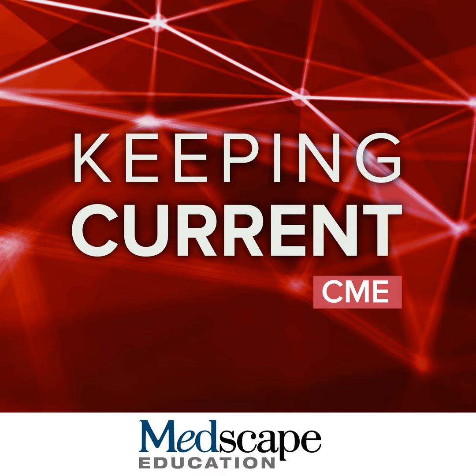Then the other categories, when we look at how we would score this, would be a subthreshold case. So here, in the middle set of images, we have an 8 millimeter lesion in the left hepatic lobe that is mildly T2 bright. That's not a cyst or hemangioma. That's mildly T2 bright and has diffusion restriction. So this would be a positive but subthreshold case that you might follow again in 3 months or do a full dynamic contrast enhanced MRI.